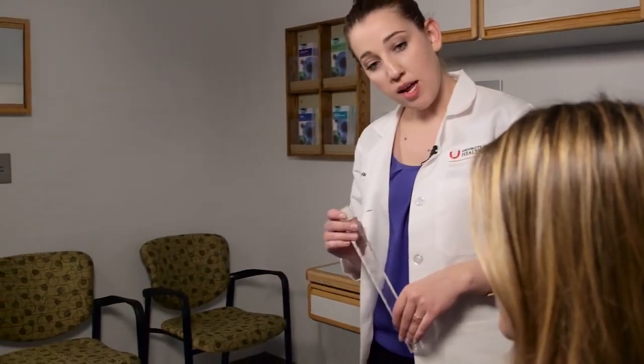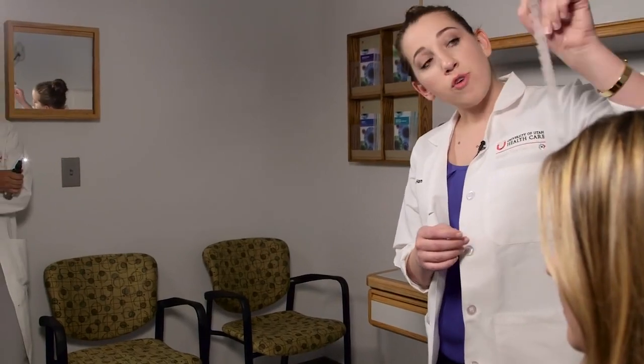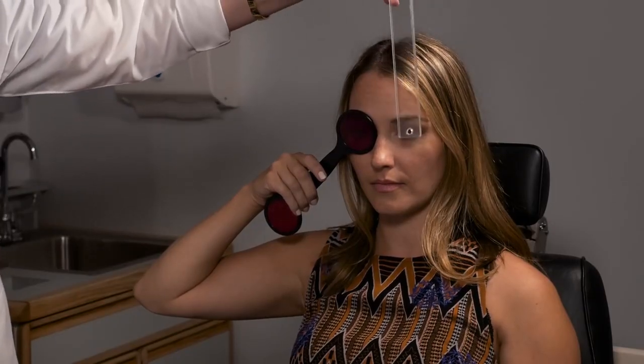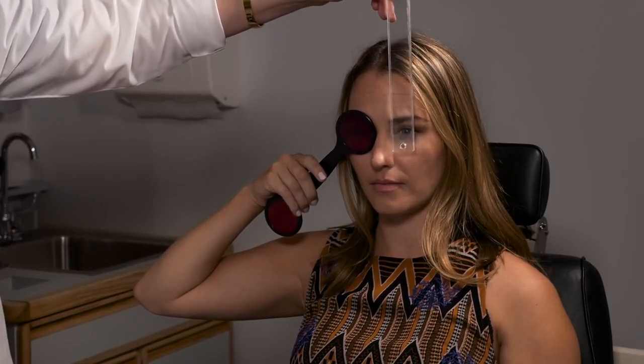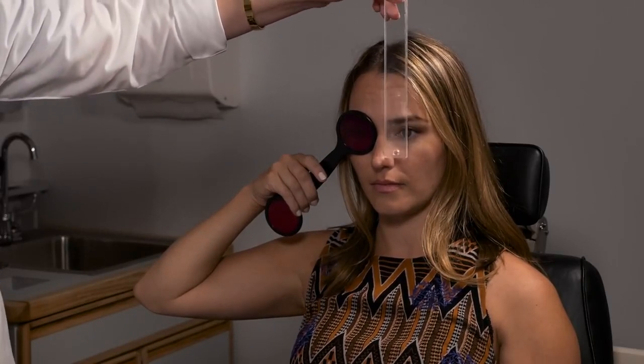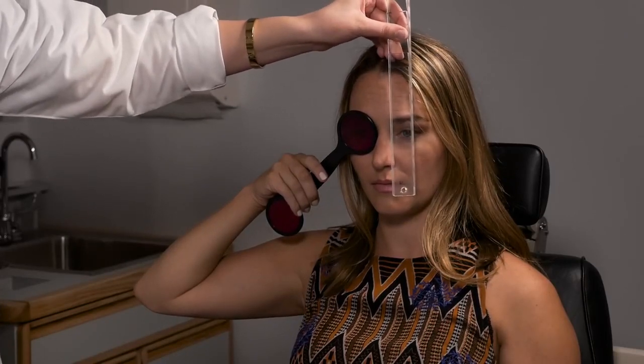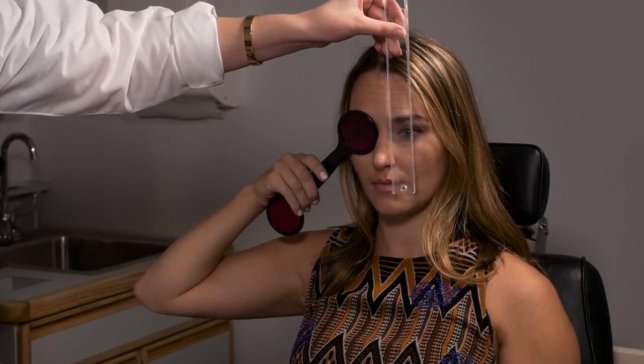Okay, I'm going to show you how to measure the deviation with a Maddox rod. So let me again have you hold that up there. So she's very well aligned, but for argument's sake, let's pretend that she had a vertical deviation. So let's pretend that the white light is above the red line. So you can use a vertical prism bar and add more prism. Since the white light is above, I'm going to be correcting a left hypo deviation. But you add increasing prism until the patient tells you that the white light and the red line are perfectly aligned.